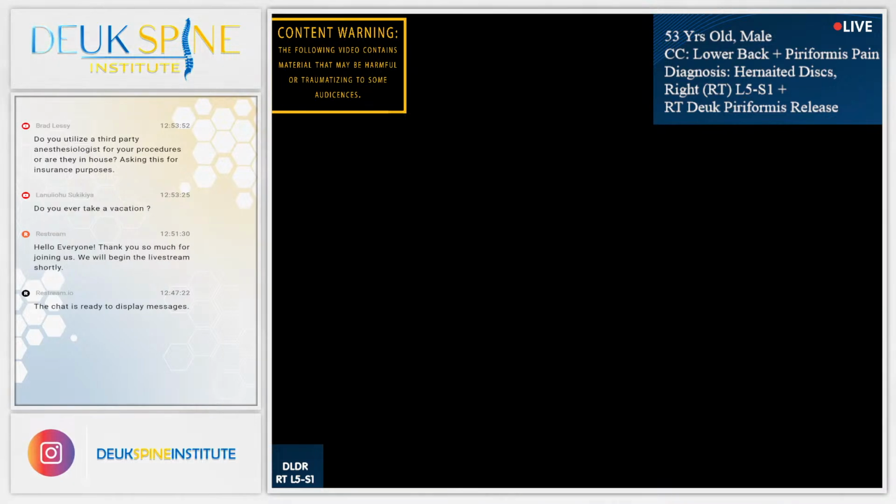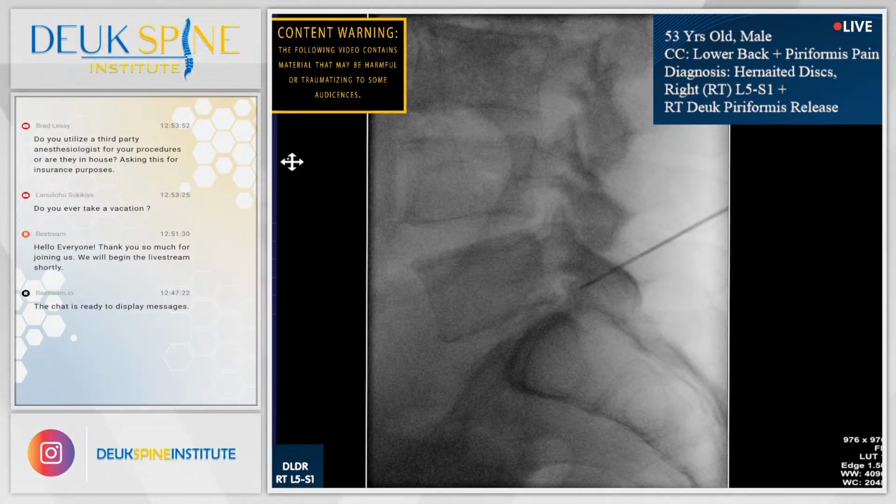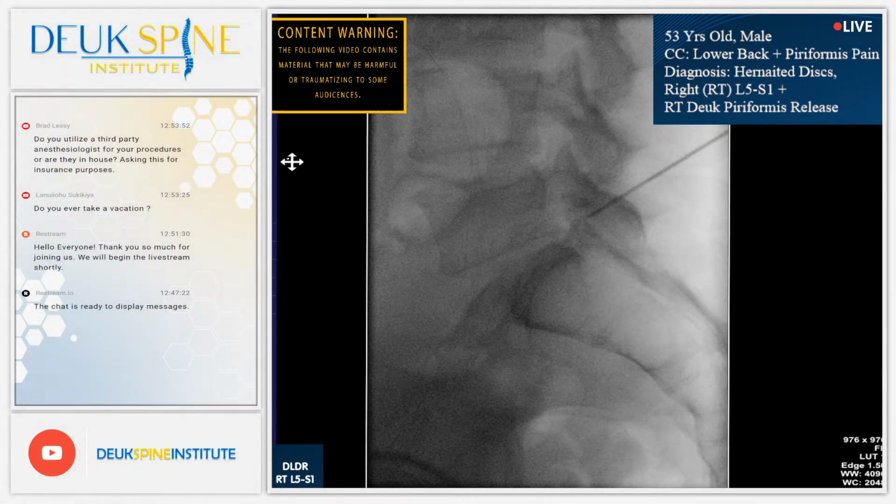We're just behind it, and Jordan is going to do two things. Number one, he's going to fix the WAG because we're off on WAG. You can see the two pedicles at L5 are offset. Now, the patient's disc was operated on, not the disc, but the lamina. He had a laminectomy done. I think it's worse, Jordan. I think it's a little bit worse. I think we need to correct it. You can see the two ears of the L5 superior articular process.